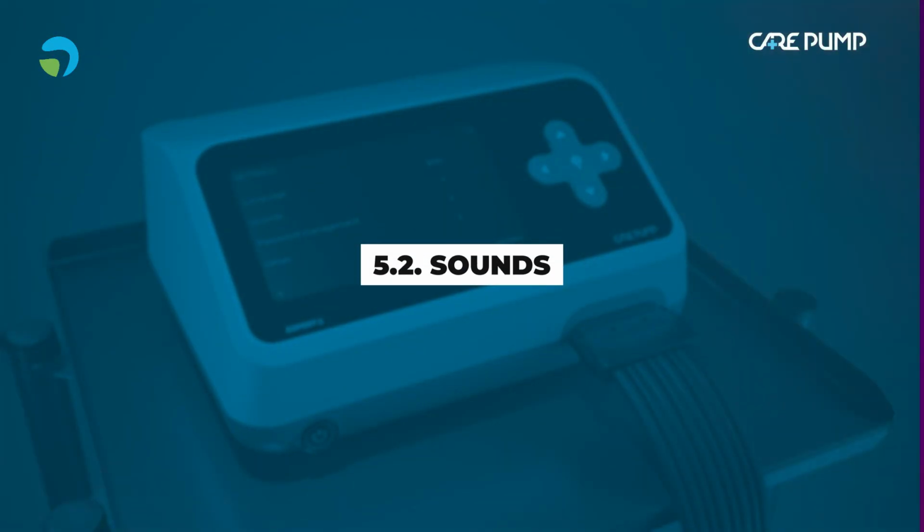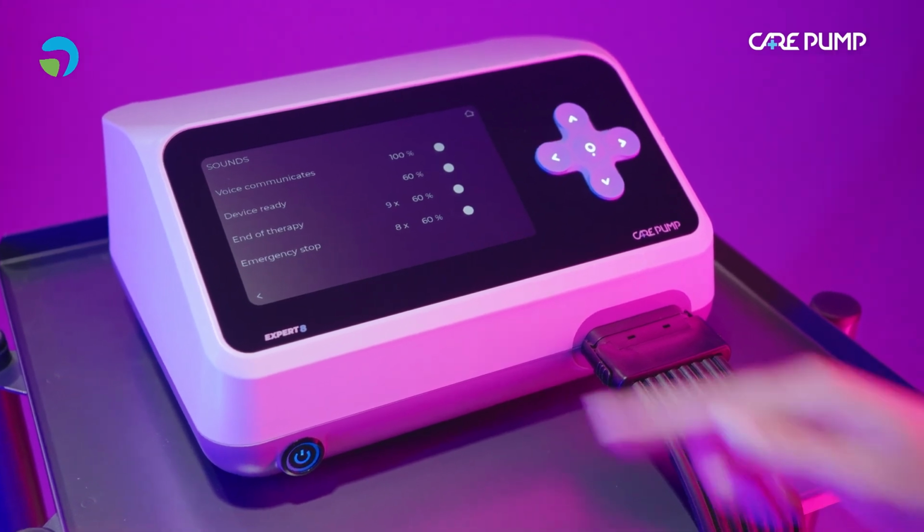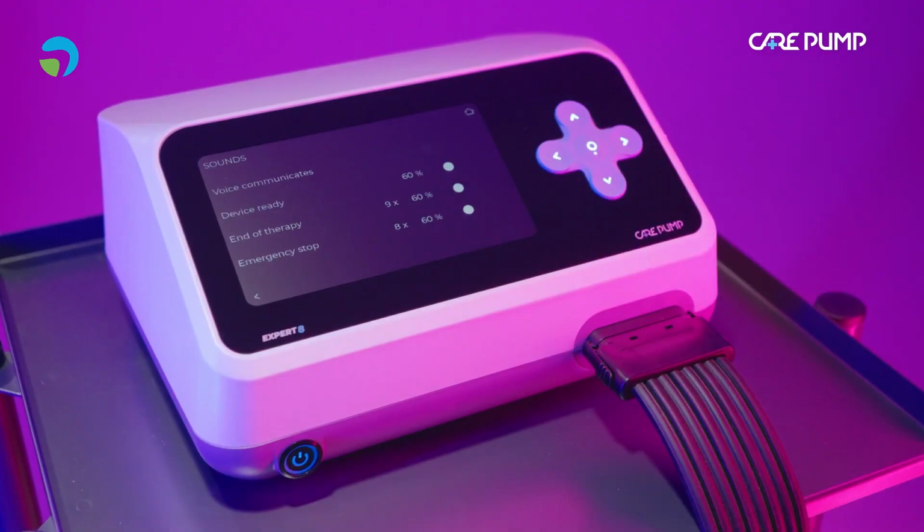Sounds. Sounds option allows you to define the volume and frequency of notifications and voice messages. To enable or disable notifications, voice communicates, device ready, end of therapy, and emergency stop using patient safety button, press the button next to each of these options. If the button is highlighted, the sound notifications for that option have been turned on.